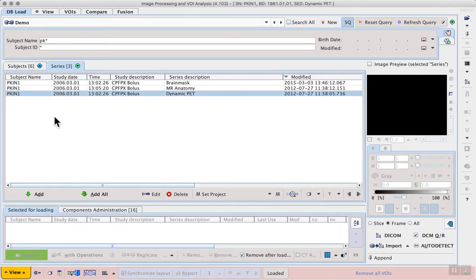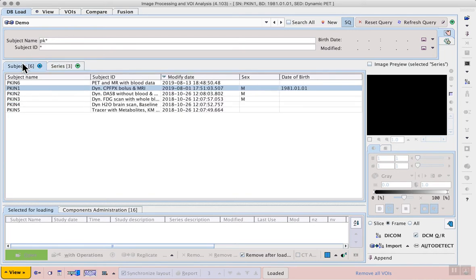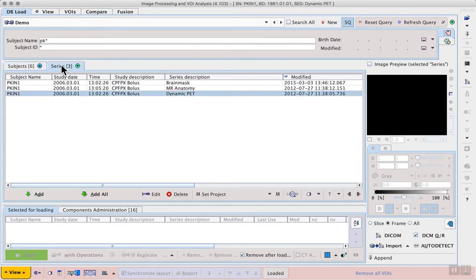I will use the example PIKIN1. From the demo database we can search for subjects with the name starting PK. This reveals six potential subjects. Select PIKIN1 and from the available series select the dynamic PET.